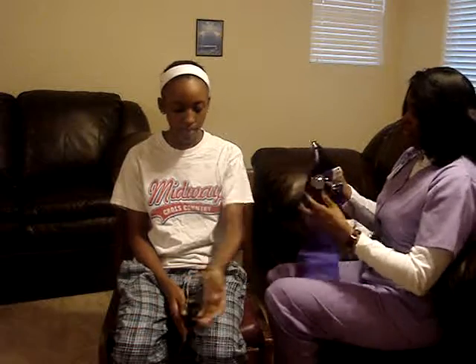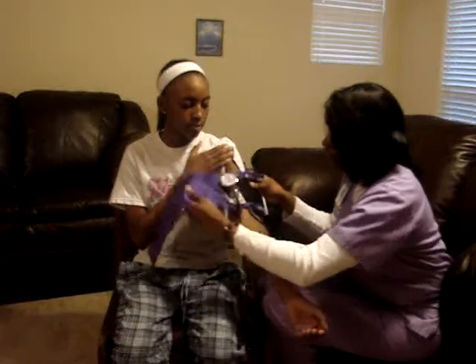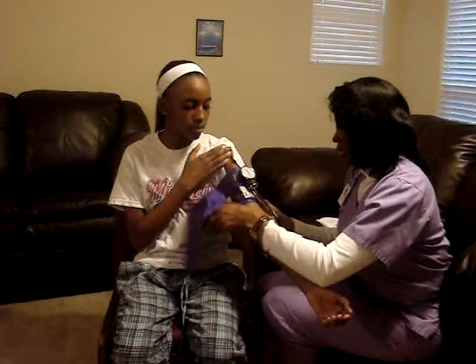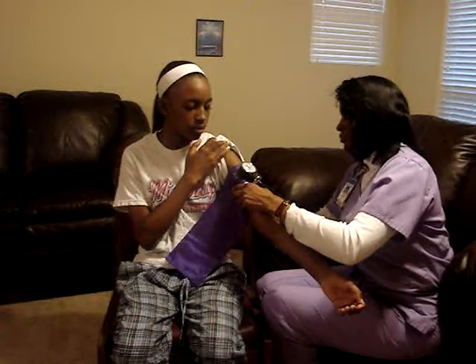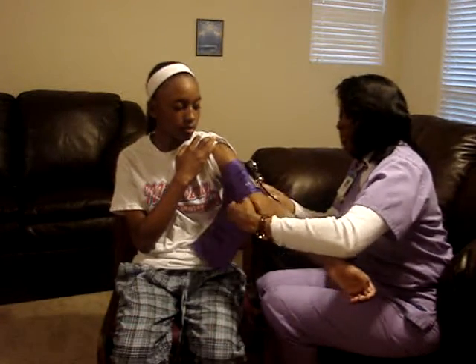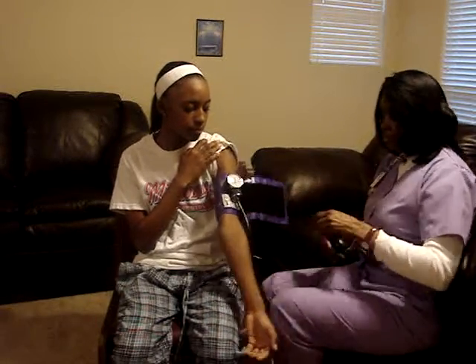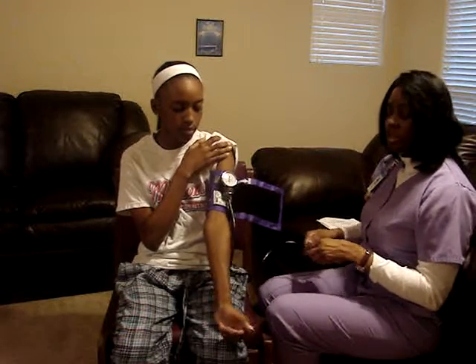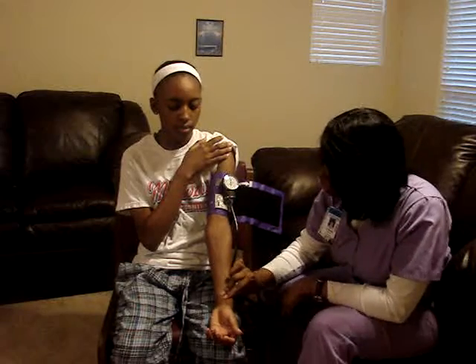Okay, I'm going to ask Hillary to stick out her left arm, and I have a blood pressure cuff that I'm going to put on her. I'm going to make sure all my arrows line up with her artery like they're supposed to. Got a little arm, but I still think this one will fit. Okay, here we go. First, before I actually start the blood pressure, I'll palpate for her radial pulse.